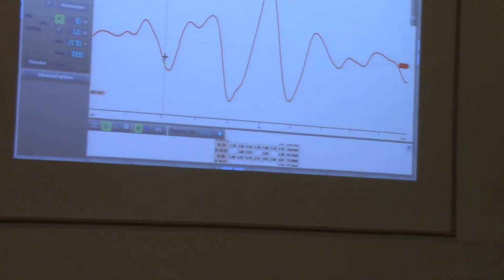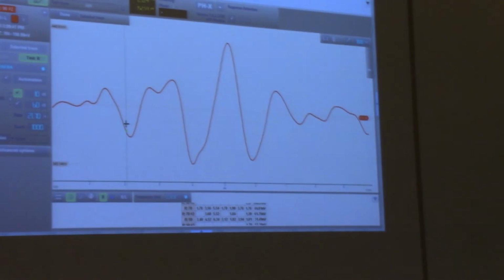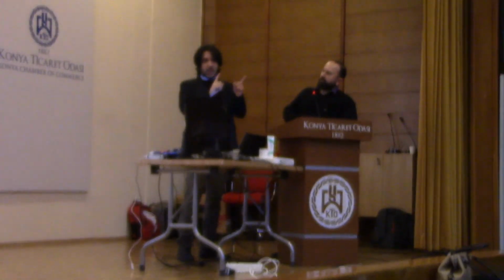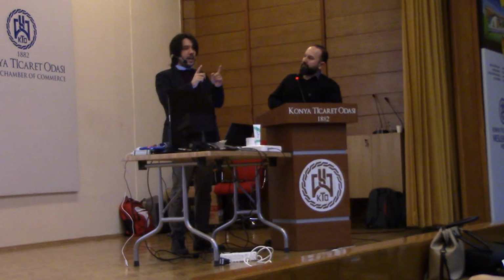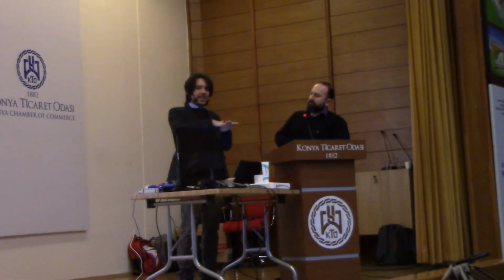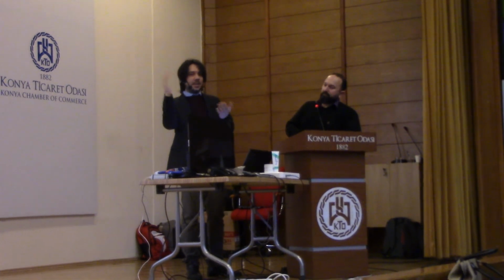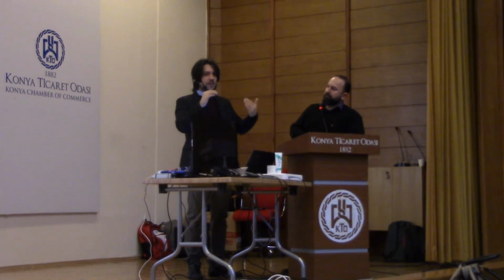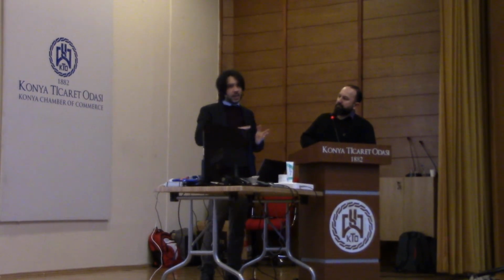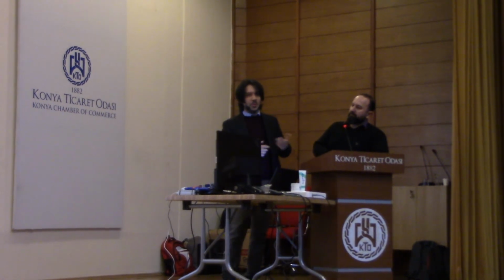This can be typically due to the fact that you have rarefaction and condensation stimulus, the alternate stimulus, but the response of hearing cells to condensation or rarefaction has a different delay, because one is activated just compressing and the other one, rarefaction, when it releases. So there's a little short delay, so that sometimes you see it in a double peak. Okay, take the second, or the best would be taking the average between the two.